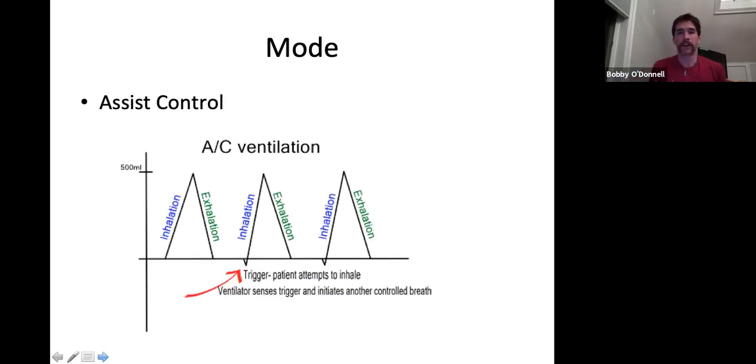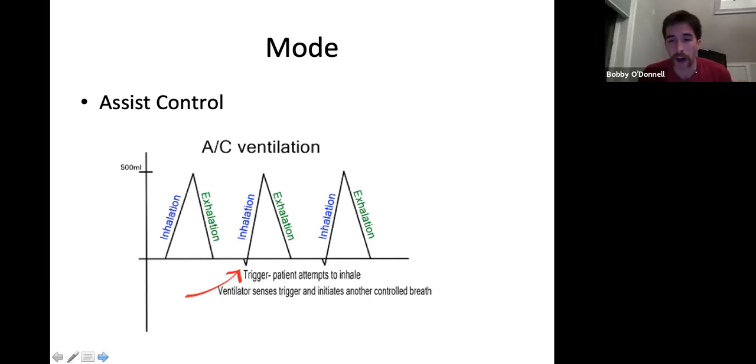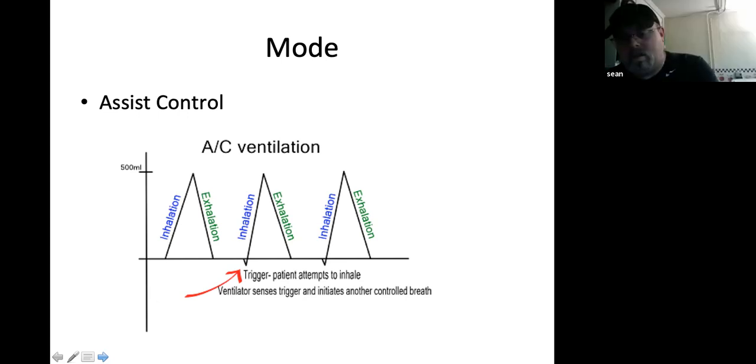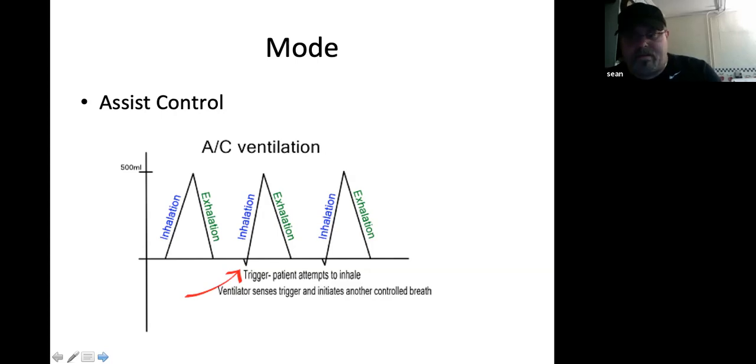Generally, sorry, Bobby. What was the name? The podcast is EMCrit. And the name of the podcast episode is Dominating the Vent. It's like 28, 29 minutes, and he really breaks it down. He's a great speaker, and it covers all the concepts that you would need to manage your ventilator in this AC setting. The name of the speaker? Scott Weingart.